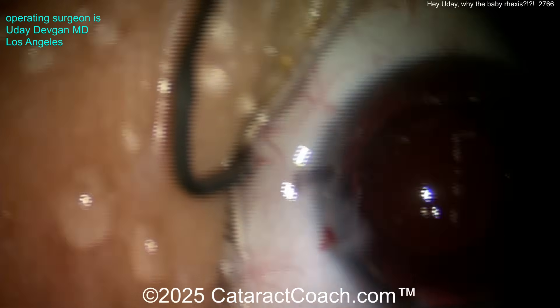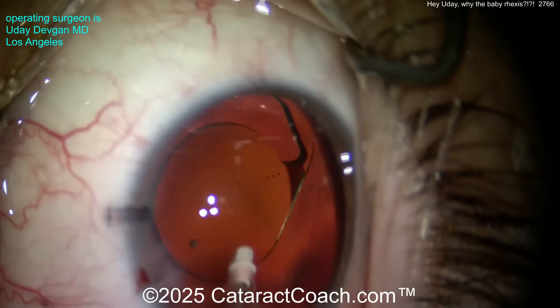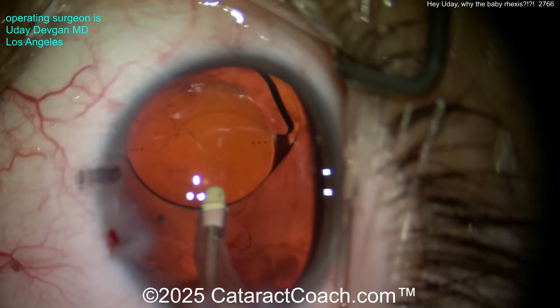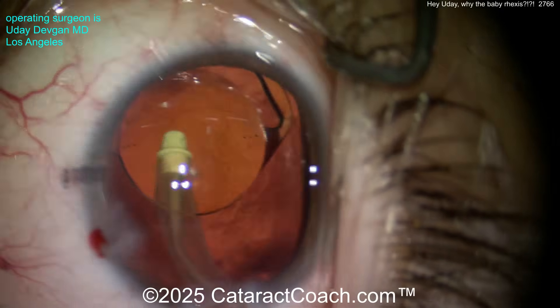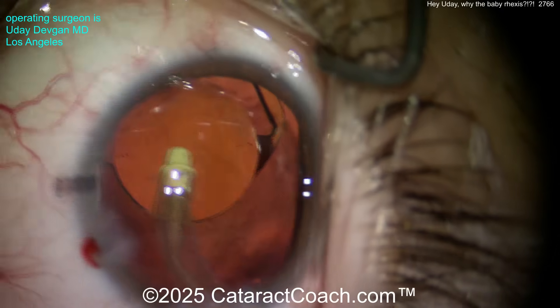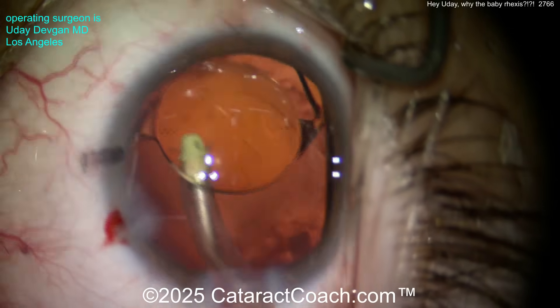The patient won't look at the light, but we'll fix that. The I/A probe going inside the eye, nice and gentle, going behind the optic to remove viscoelastic. I hope it's helpful for younger surgeons to see these complete cataract cases — start to finish, no edits, the whole case.